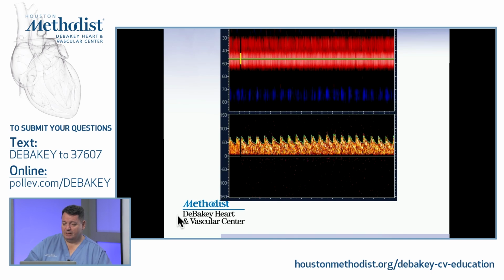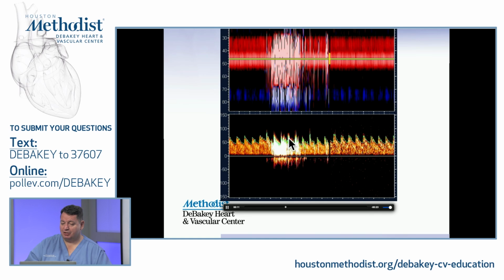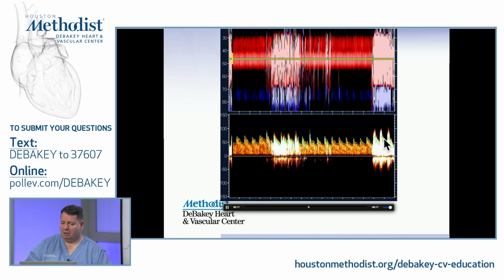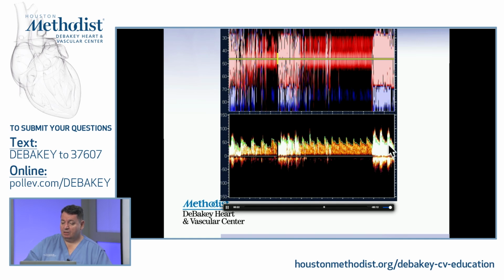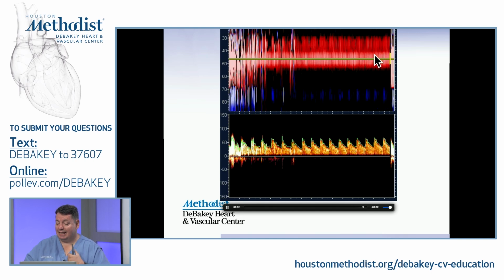Here's another good Valsalva. Before the Valsalva, I already have a shower. And the little Valsalva was enough to open up a second shower. This is where we call it almost like a curtain, when the entire screen is just whited out. But again, the sharp, nice sound, it's impossible to miss.